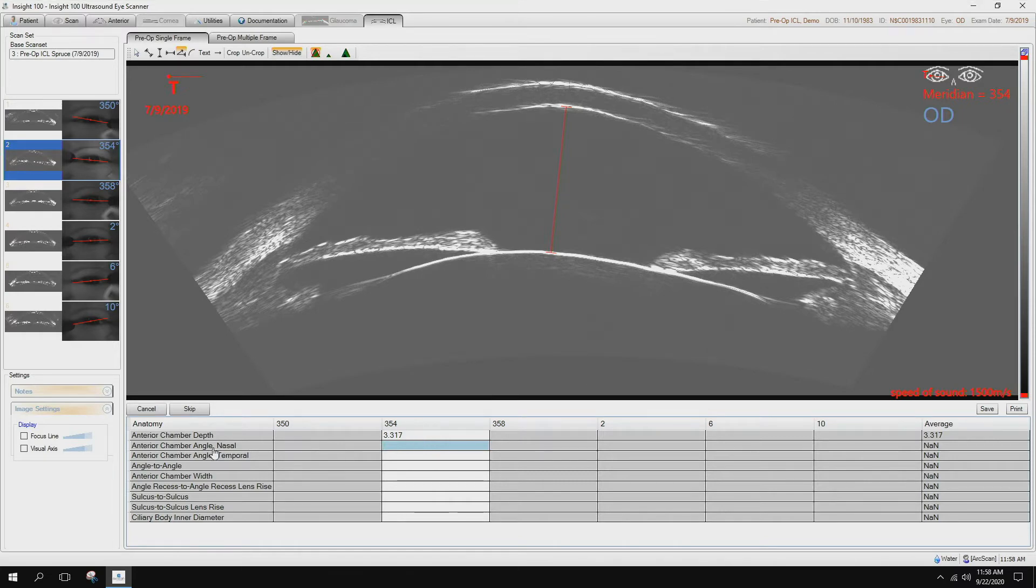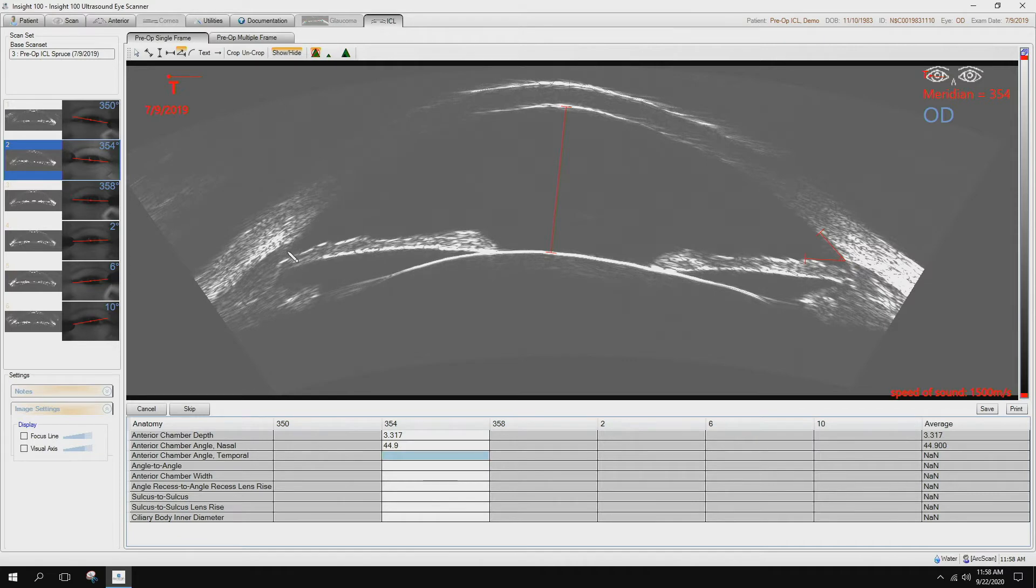Anterior chamber angle nasal, again this is temporal on this side, so we start here. Scleral spur. Go to temporal, scleral spur.